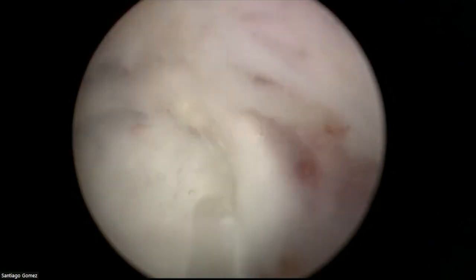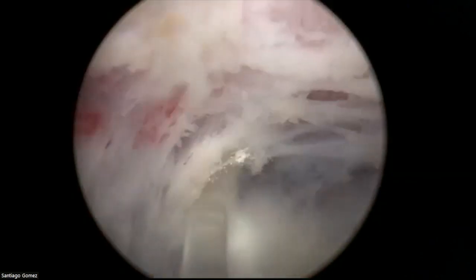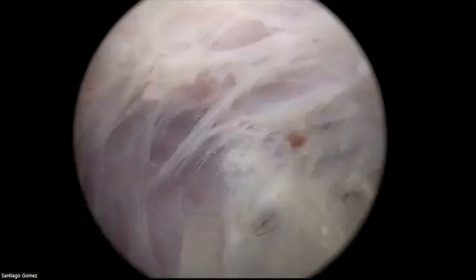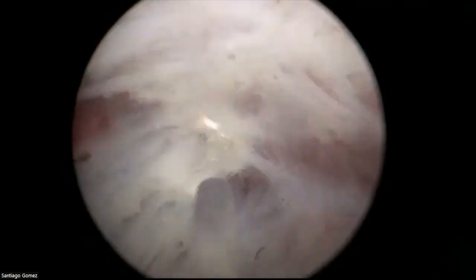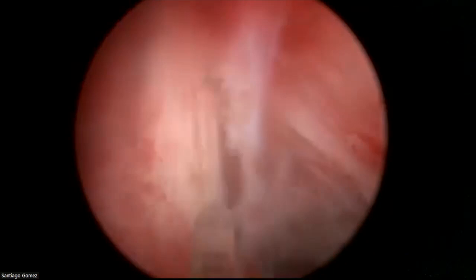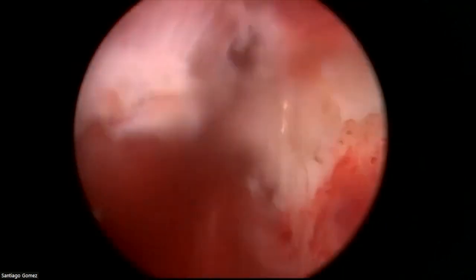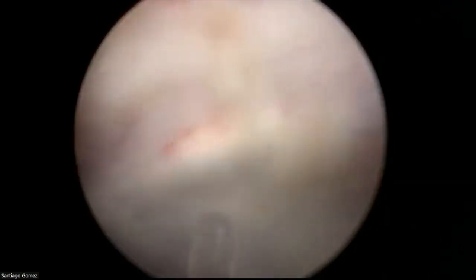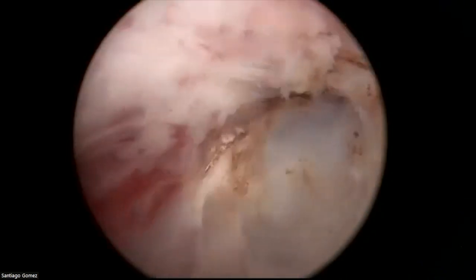So the idea is that this technique consists of a series of steps that are designed to allow for a tension-free release of the sphincter early in the operation, not immediately, but early. And that will provide excellent clinical results. We don't worry anymore about post-operative stress incontinence. We don't tell the patients to do Kegel exercises. We tell them it's quite unlikely that they will have incontinence postoperatively, because the rate of postoperative stress incontinence is lower than 1.5%. So it's very, very low.